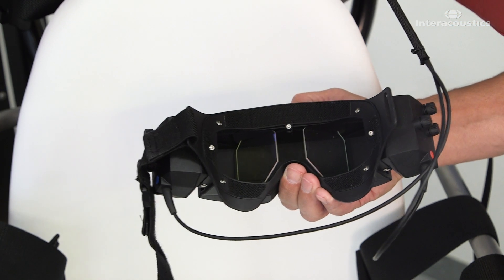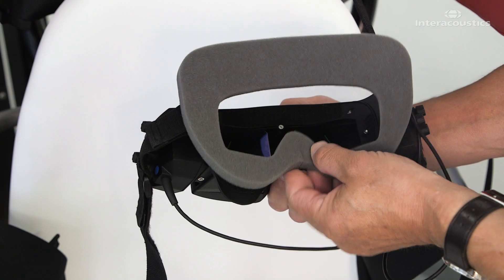Finally, make sure to clean all surfaces and change the foam cushion on the goggle.